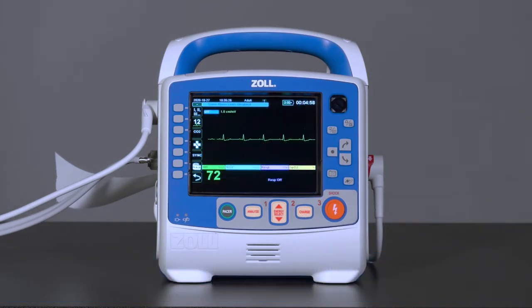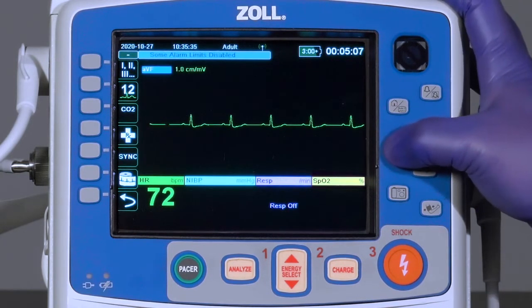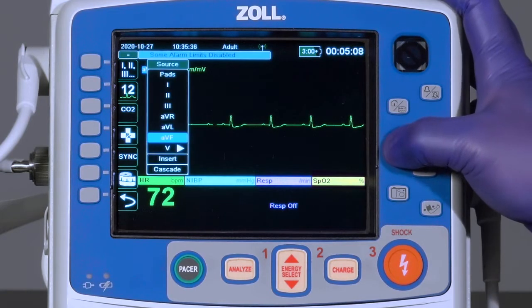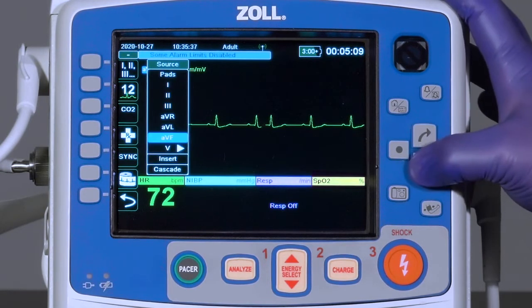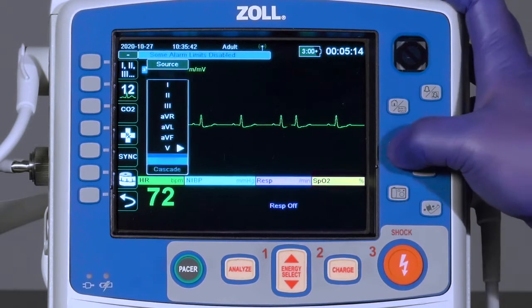Multiple ECG lead views, as well as other available waveforms, can be added to the screen. Highlight the lead label, such as lead 2, and press the select button. Scroll down towards the bottom of the drop-down menu, select insert, and press the select button.